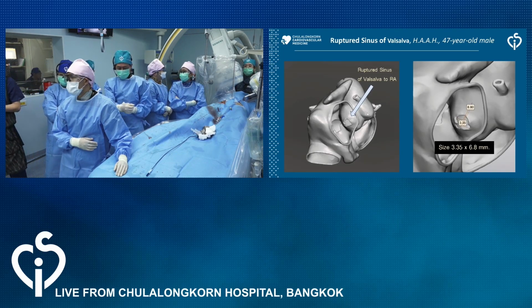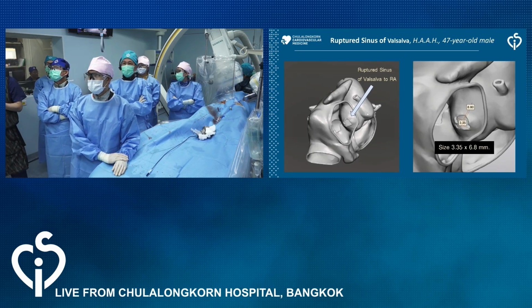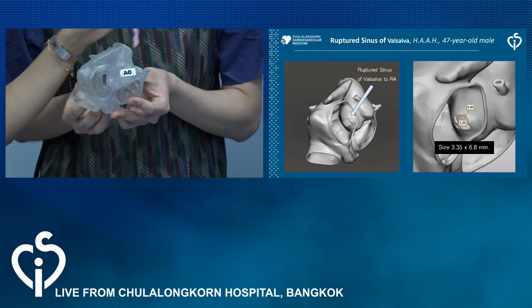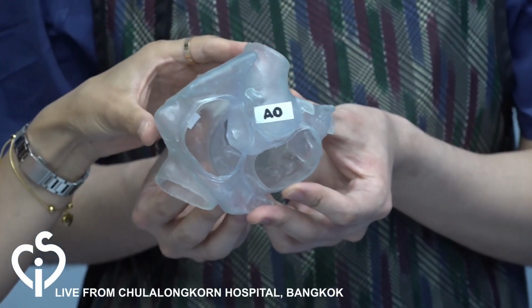Thank you. It's a very interesting and very nice demonstration of the 3D. I would go ahead and close it. I think it's important to rule out any possible causes for this LV and pulmonary hypertension. That might be part of it, if not all of it, so we have to rule this out.